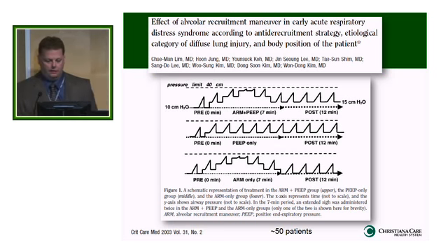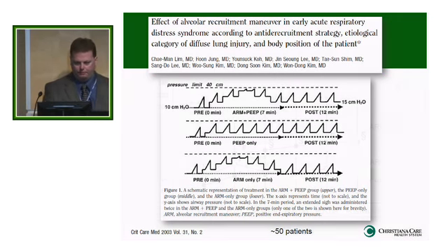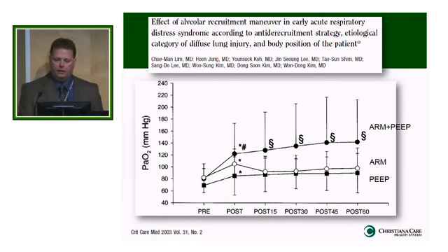And what they found is, oxygenation-wise, the best and lasting effect was, as you would have guessed, you recruit them. They did an alveolar recruitment maneuver. That's what ARM stands for here that I put in. They did the recruitment maneuver plus the PEEP increase, and they get the longer lasting effect. And look at this. For anyone out there who ever tries a recruitment maneuver, but then the doc won't go for higher PEEP afterwards, the recruitment maneuver gave better oxygenation. It gave you that, patient looks better. And they went right back down to where they were before, basically. So if you're going to do a recruitment maneuver, you really need to add the PEEP after it to PEEP the patient properly.